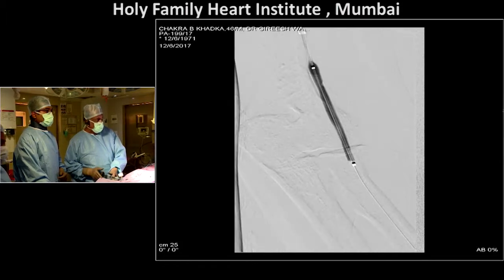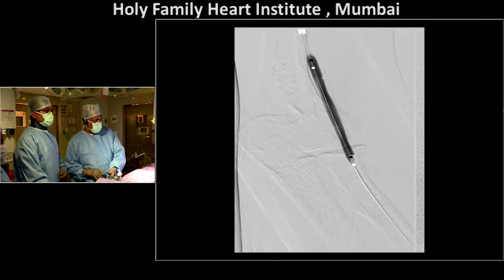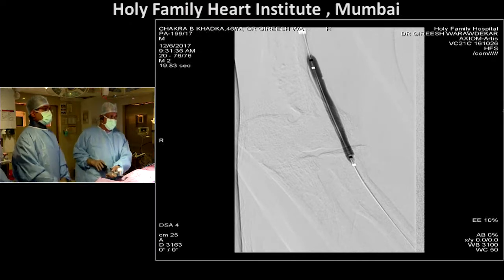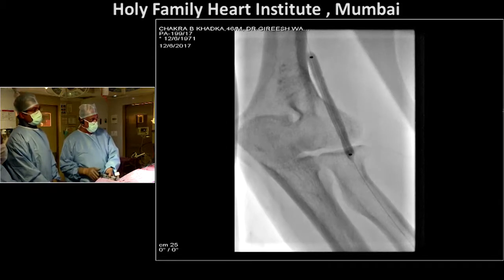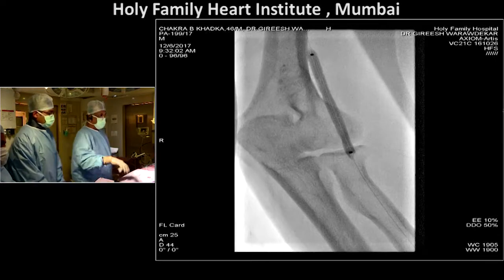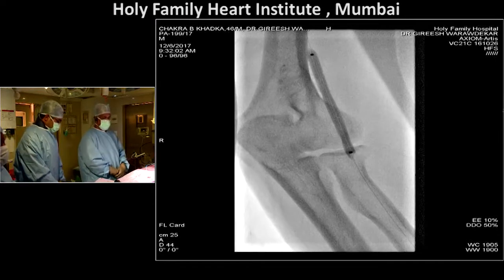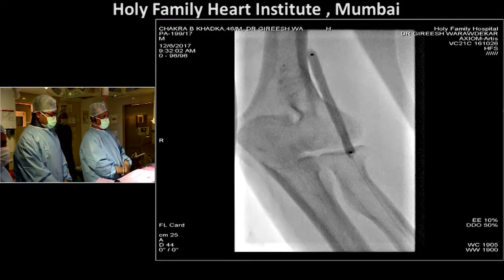Yes, you can see that lesion over there. There's one segment which is not really opening up, just about a centimeter from the distal end. It's only at 2, though the nominal is 7. Okay. This is just ironing out the segment there and clearing whatever little narrowing. This looks nice and big, Gireesh. Yeah. I think we'll hold on here. So you want to have a prolonged dilatation here. Correct.